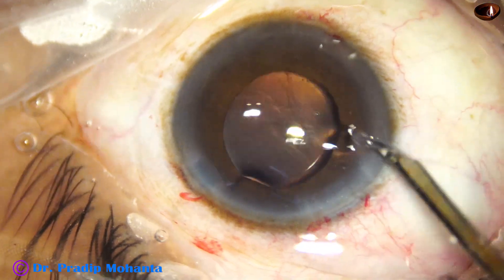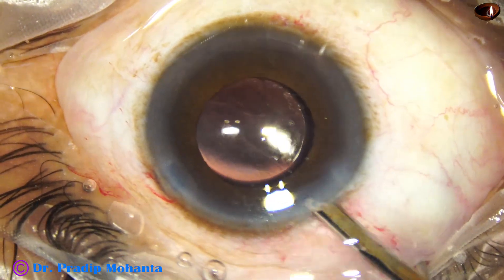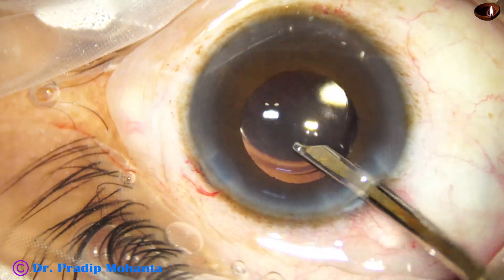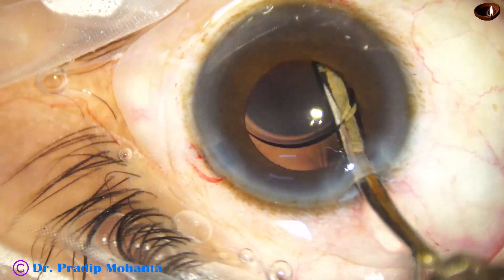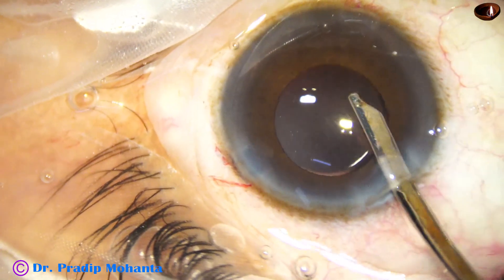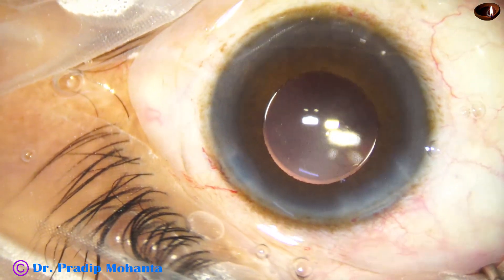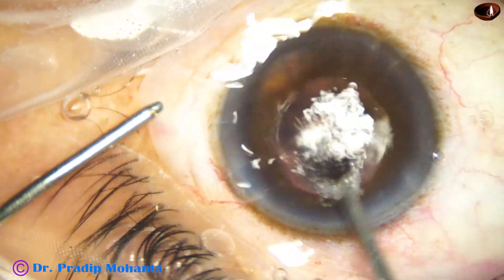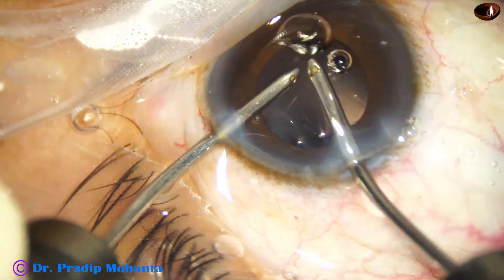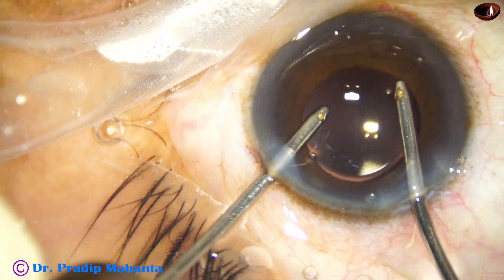Now, a very important step — cleaning of viscoelastic. The 23-gauge Simcoe is being used to remove viscoelastic. First I irrigate; there is irrigation and also aspiration through the aspirating port. Some BSS is irrigated in the anterior chamber and in the capsular bag, going behind the intraocular lens — we must go behind the intraocular lens and must not allow any viscoelastic to get trapped behind it, as trapped viscoelastic causes raised intraocular pressure. I am using bimanual IA to remove the viscoelastic again from behind the lens.